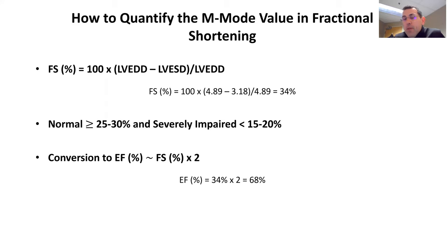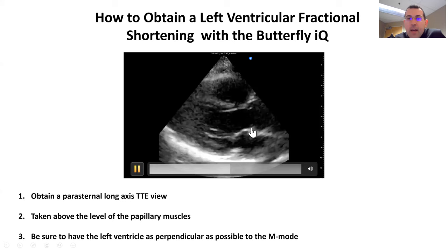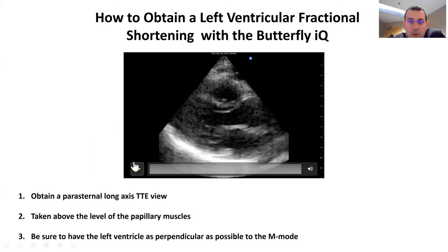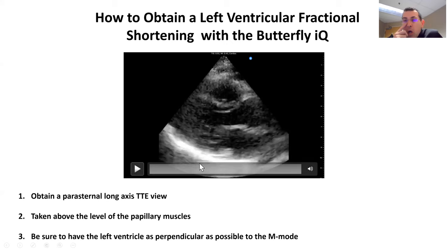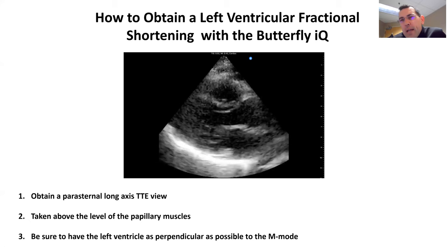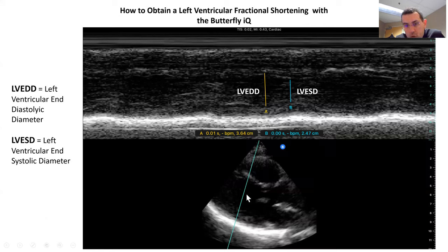Another way to do it is to take a parasternal long axis view. Here, instead of getting the donut view and putting the M-mode line straight down, we put it on a slight angle through the left ventricle above the papillary muscles. That angle introduces a small angle error, which is one reason we tend to prefer the short axis approach. However, if you remember that these are all approximations, that's an acceptable small error to have.